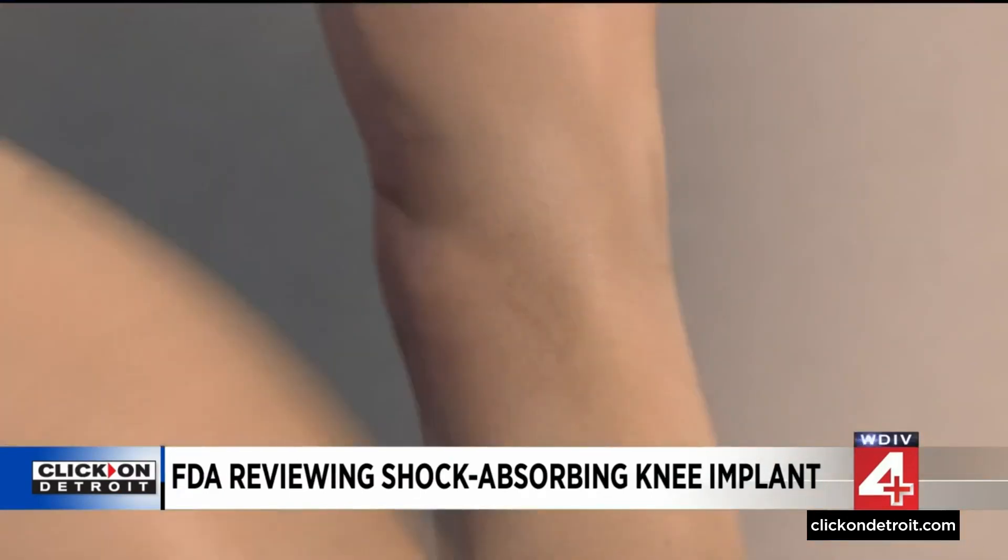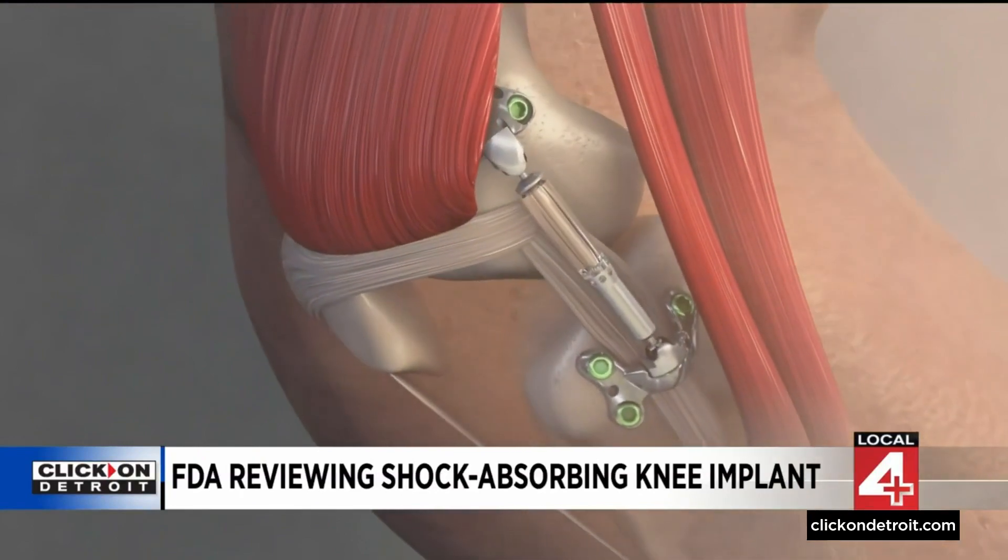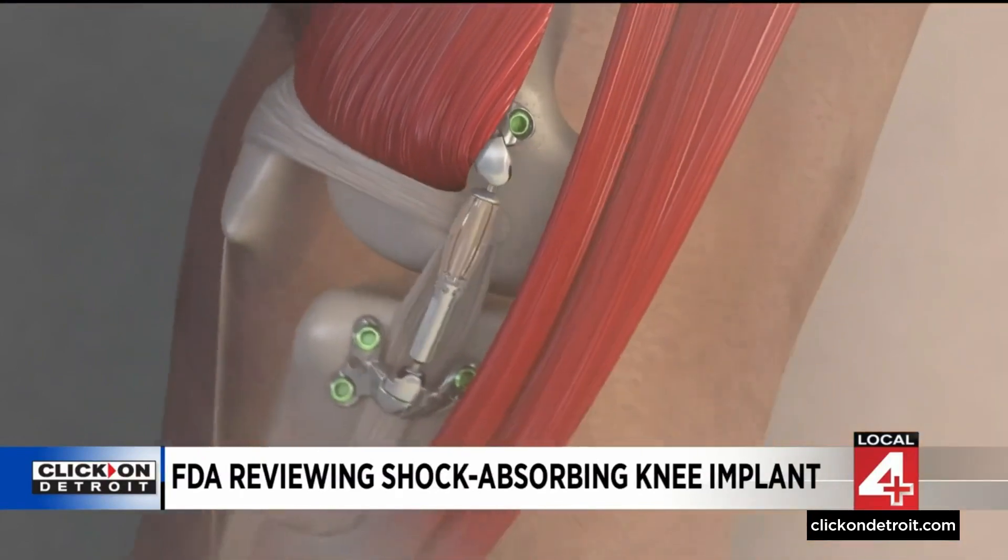The device, known as the MESHA system, delays the need for a knee replacement. When you're walking and doing activities, it's going to take about 30% of that shock or stress on the knee every time you actually put weight on your leg.